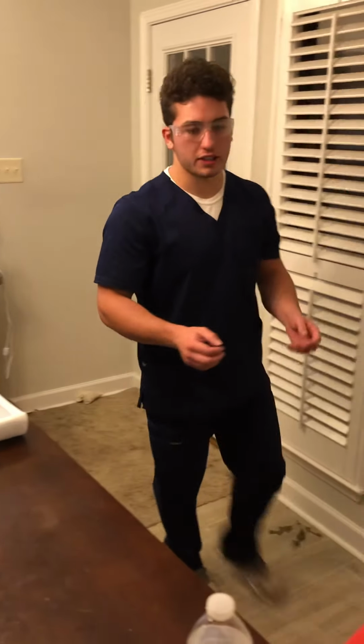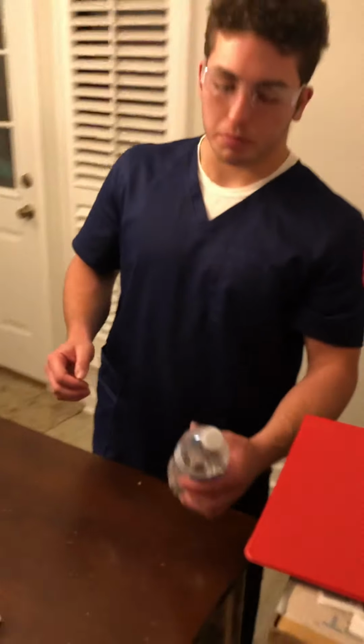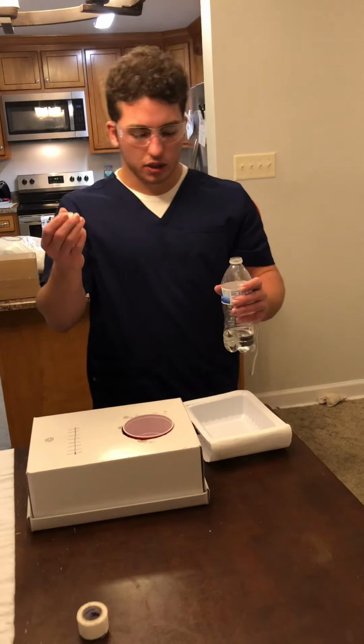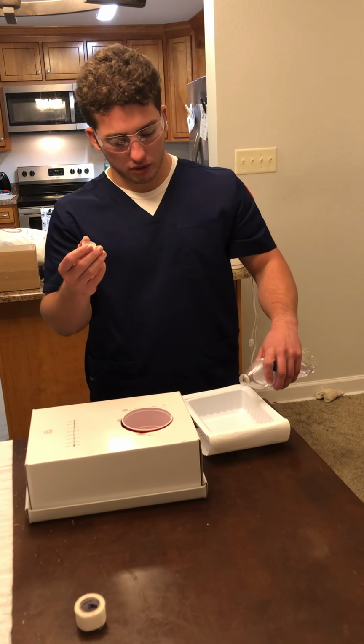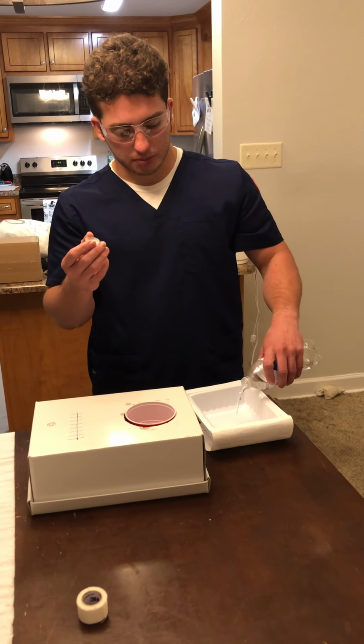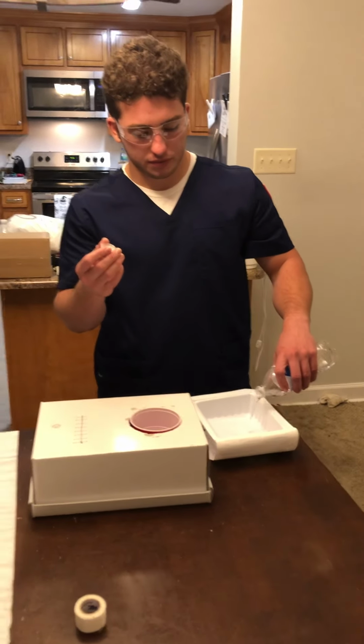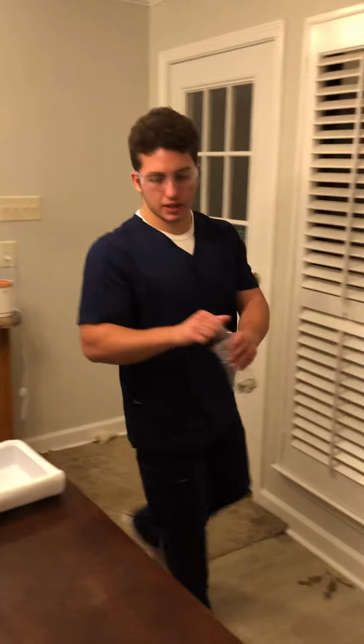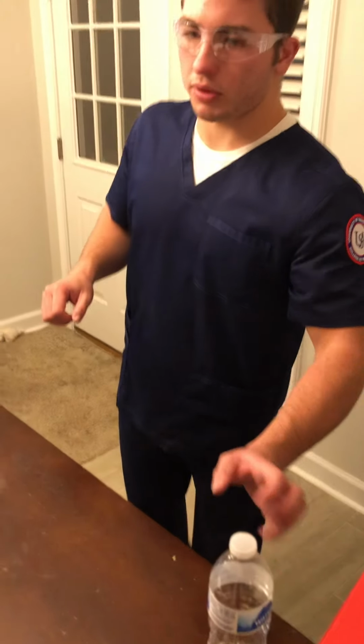I'm now going to take my normal saline, verify that it is in date. I'm going to grab it, palm the label, open the cap and keep it up, gently pour it into the basin, ensuring not to splash onto my sterile field. I'm going to recap the saline and set it aside. Now going to don my sterile gloves.